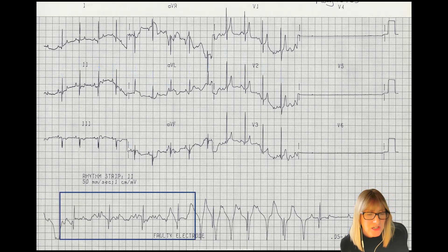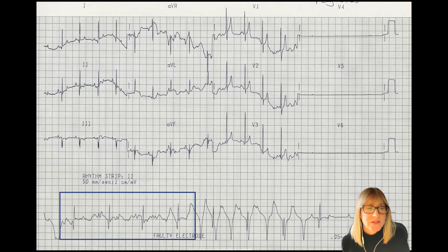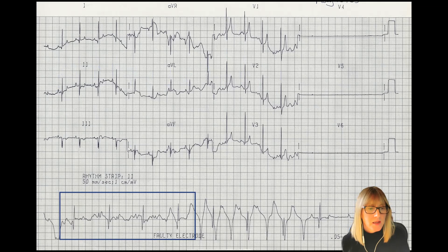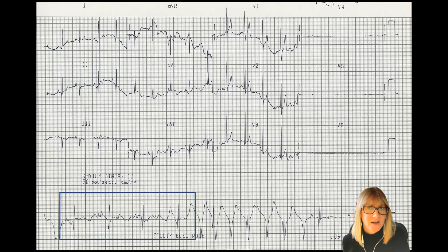Let's move to the bottom section, starting on the left-hand side. Things look a little more messy here. I know from lead two in the top three lines — specifically on that second line — what the PQRST should look like. When I play the matching game along the bottom, the QRSs look pretty identifiable, but the P's, the baseline, and the T's in between show a lot of additional deflections. That's suspicious for some overlying artifact.